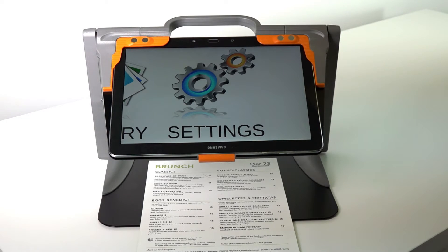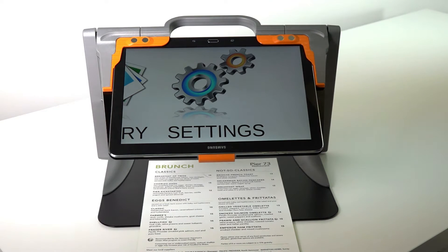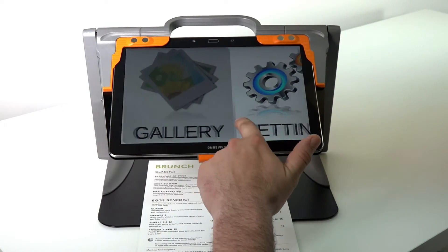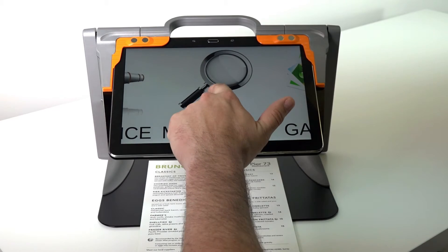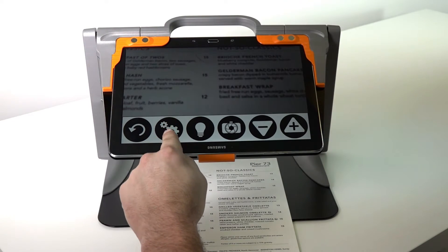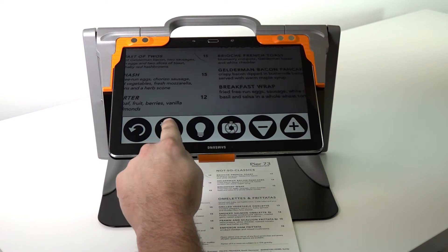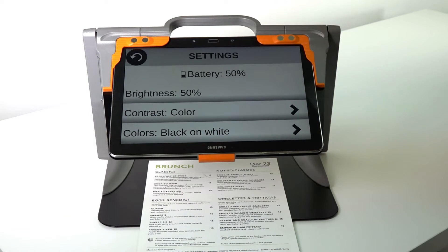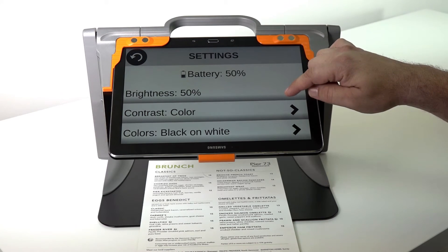Prodigy Connect 12 can be customized to various settings along with your visual situation. You can do this in two different places: either from the main carousel by tapping on settings, or when you're directly in the magnifier on the button banner. The second button to the left is the settings button, and if you tap on it once it brings you right into the settings that you can modify on the fly.